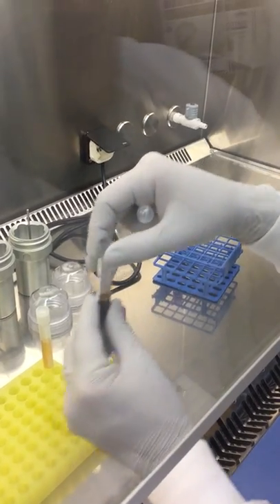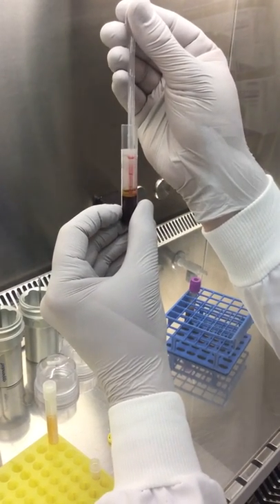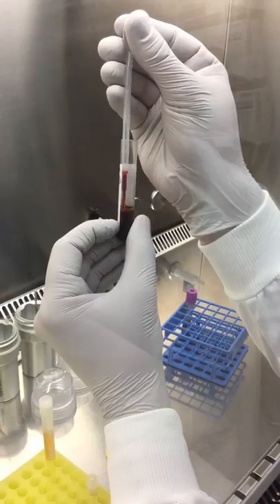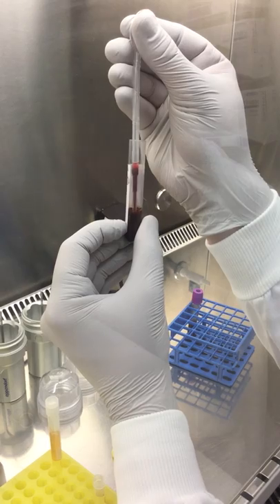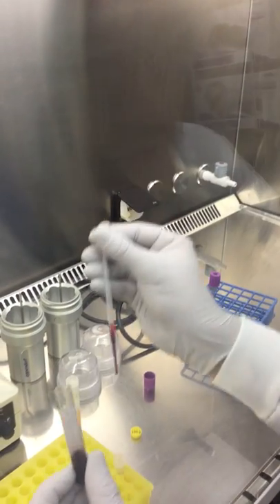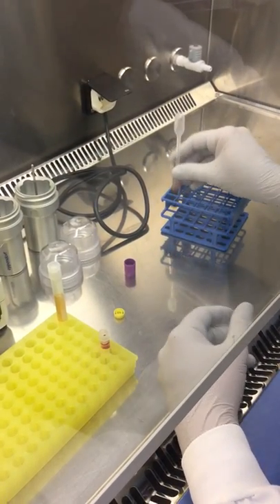I'm going to take the Buffy Coat off of both of these. So again, hover just above. Feel free just to swirl the pipette around the top, pulling up as much as you can of the white cells, and avoiding too many of the red cells.